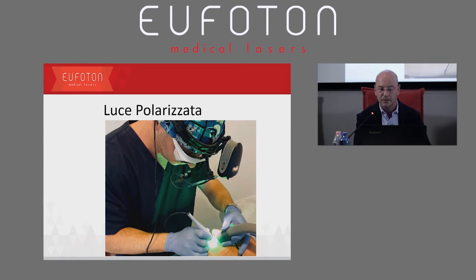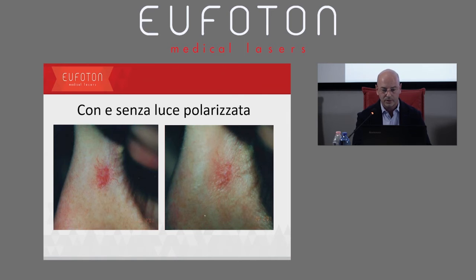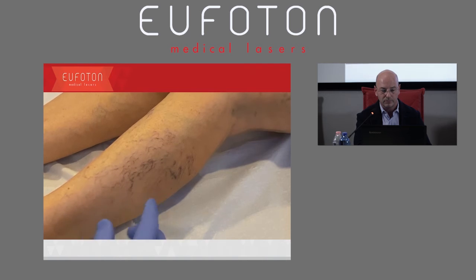Polarized light is of paramount importance for you to work on spider veins. Without it, you can't do much. You can't really use this device properly. In this picture, which was taken a while ago, I am using Cyrus. I have been using polarized light for a while now. In some cases, it's even lighter. Two pictures. They don't really describe thoroughly what I've just explained because the difference here is not clearly visible.